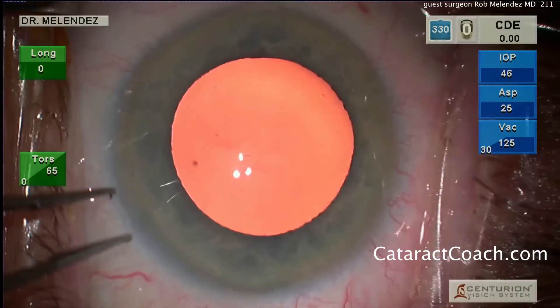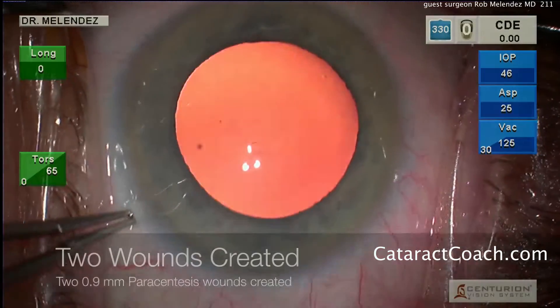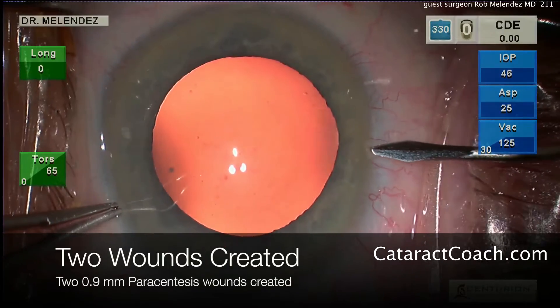This is CataractCoach.com, and today we're watching a video from a guest surgeon, Dr. Rob Melendez. So let's watch him here.